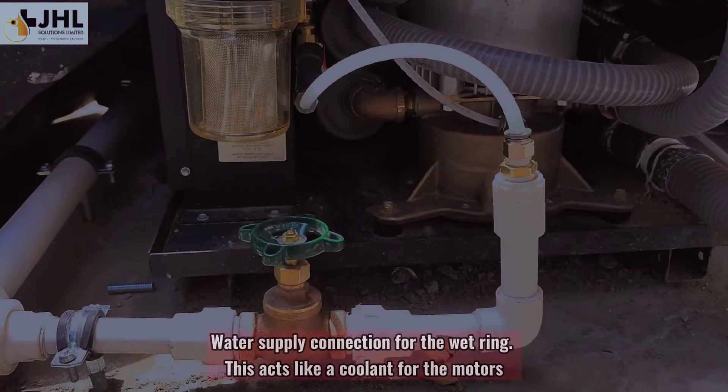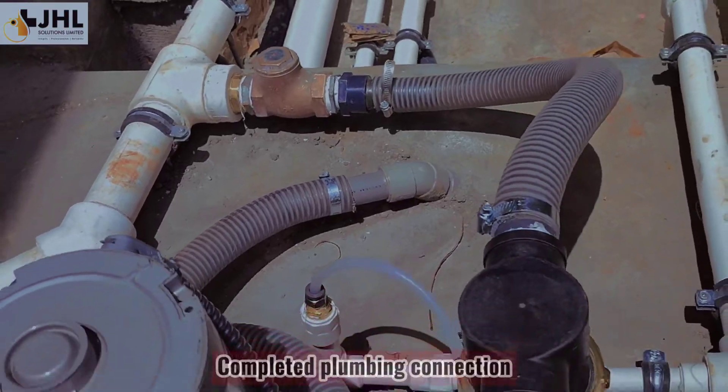This acts like a coolant for the motors. Completed plumbing connection.